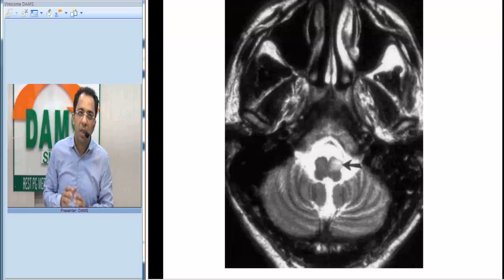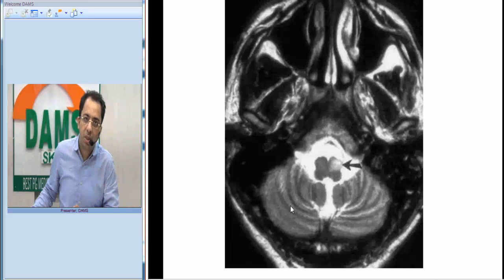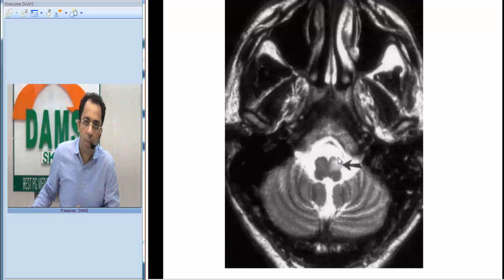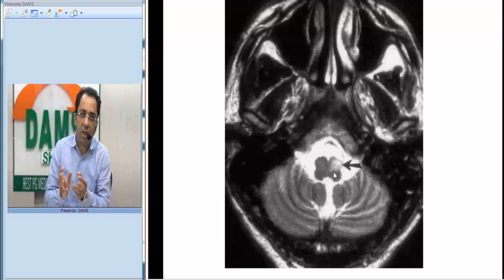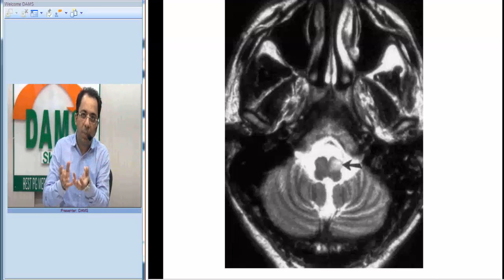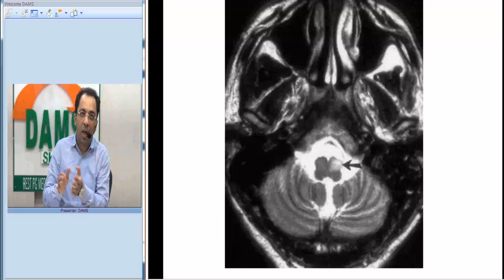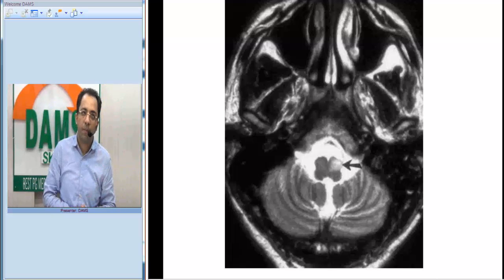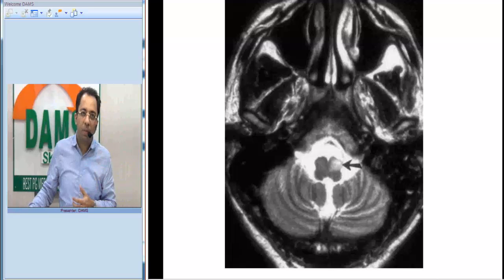You can see the cerebellum and you can see the medulla. What is the finding? You can see a bright area which is appearing hypertrophic in the anterior part of the medulla, representing a hypertrophic olivary nucleus. This is a very important condition to know.